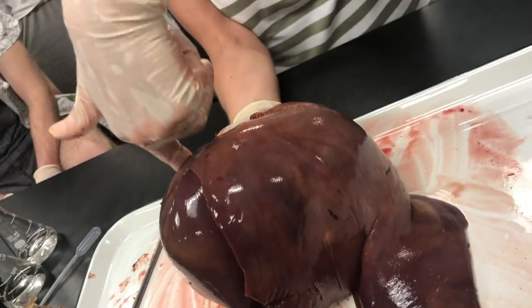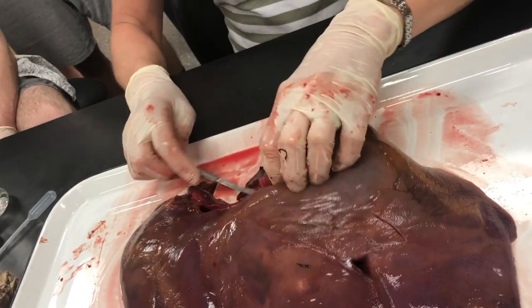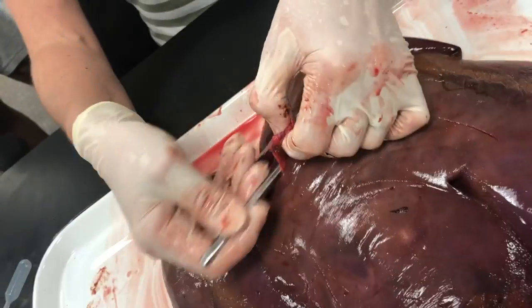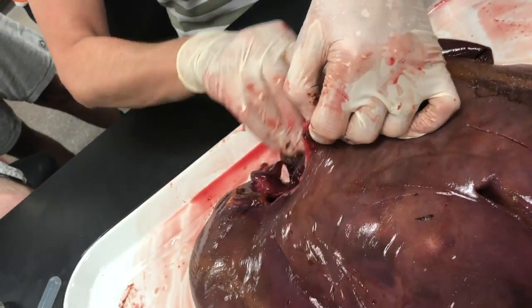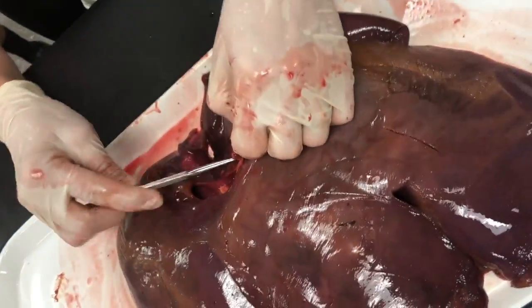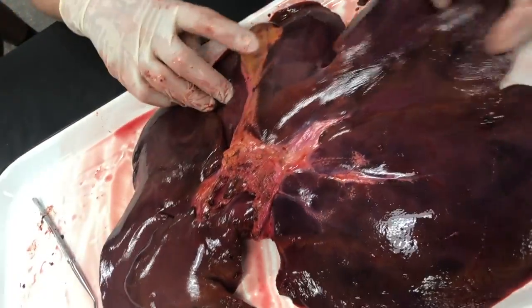And then going through this part of the liver. And then coming into that structure from each of the lobes, I'm gonna have my hepatic vein. See how that works? Cool, huh? So I can kind of feel where the probe goes into all of those different veins. And then they merge into this, and they go back to the heart. All right? All right, on the other side, the other cool thing that we see is, of course, this.